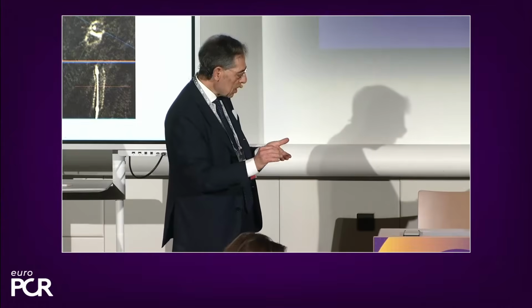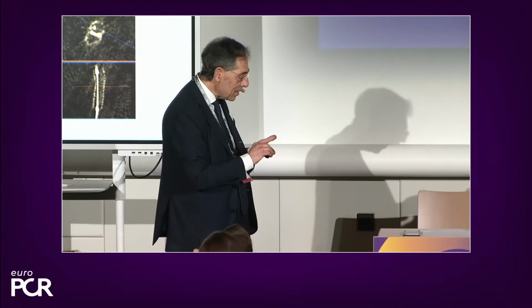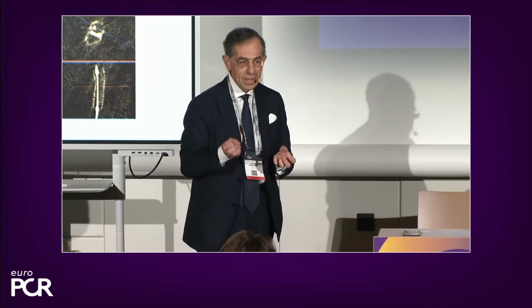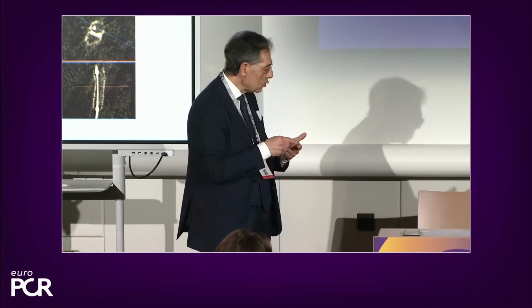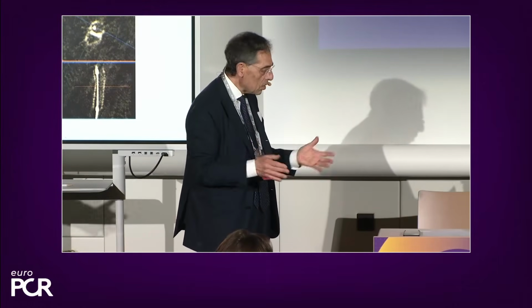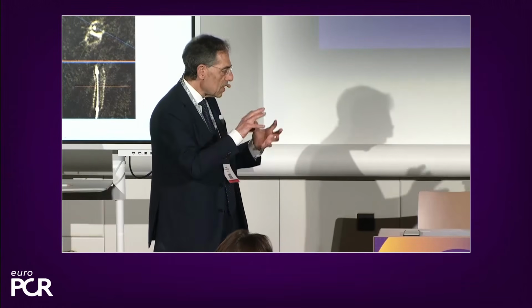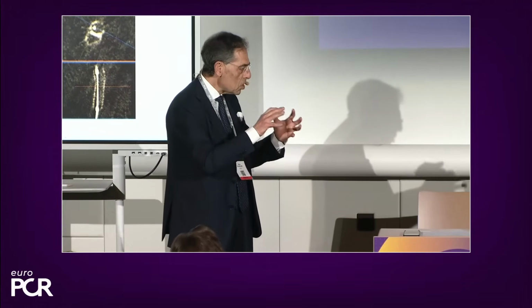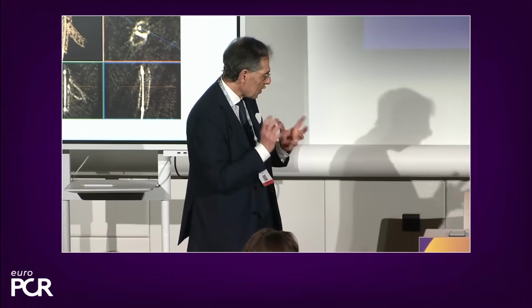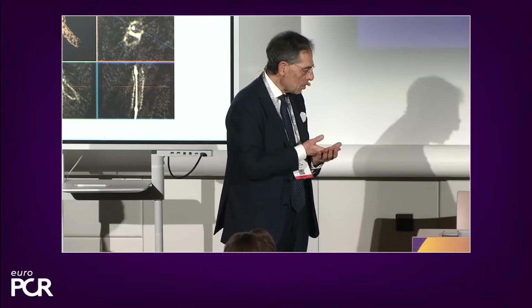And pushing the fact that the baseline is the most informative, because you get all this data about calcium, morphology of the plaque, is it soft, is it hard, from where to go. So in fact, the concept of imaging today is moving from using it only at the end of the procedure for assessing, to trying to plan and map the procedure before.